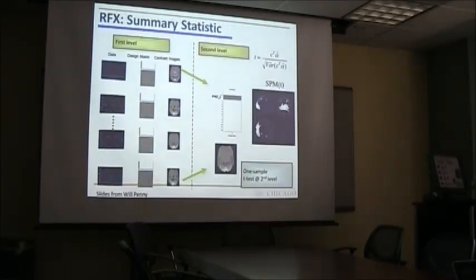This is a slide I stole from Will Penny, one of the developers of SPM, which visualized this whole process a little bit, and it's kind of nice because it has some of the images from how it looks in SPM. So say this is at the first level or subject level, you have these fits for different subjects. You have a design matrix, and we're going to look at it in the second hour a little bit, how it's usually visualized in SPM.